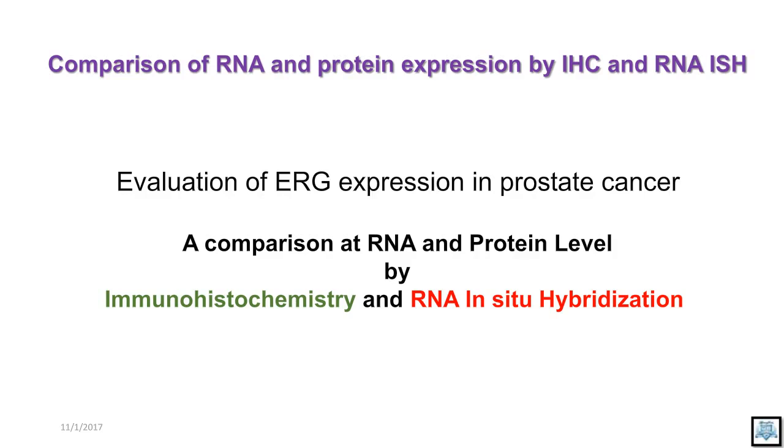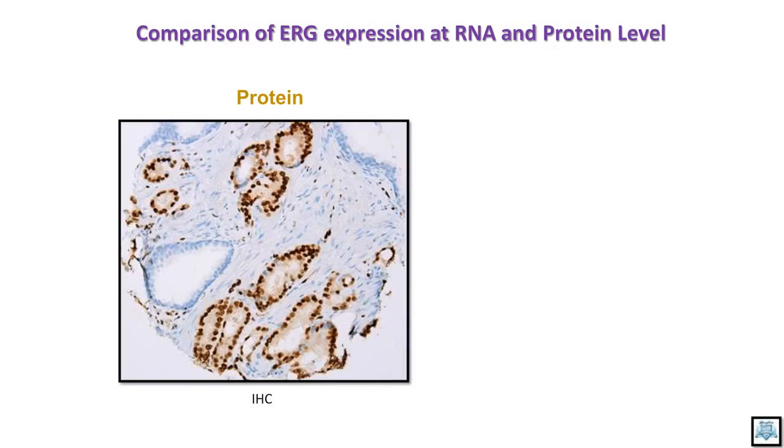So for that, as I mentioned before, since we have a good antibody for the ERG gene, we got both the antibody and we developed the RNA hybridization probe for ERG. And then we were trying to compare the performance of the RNA versus immunohistochemistry.